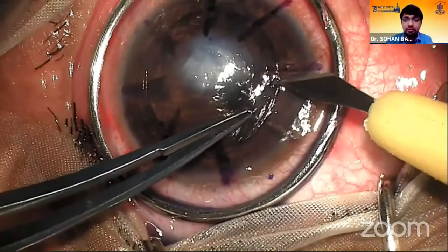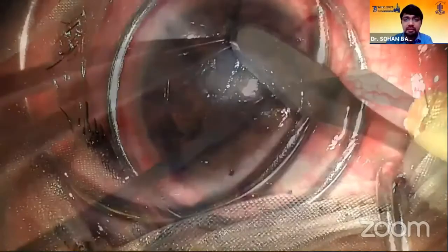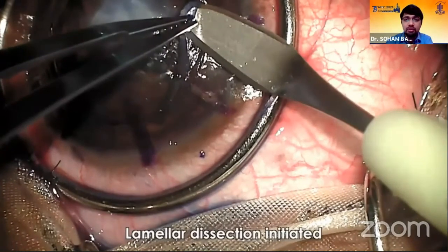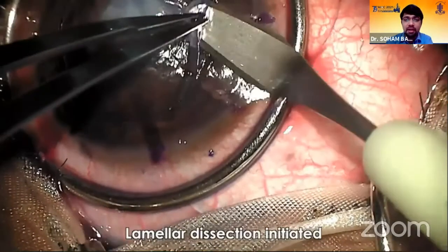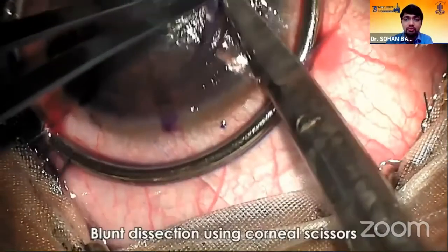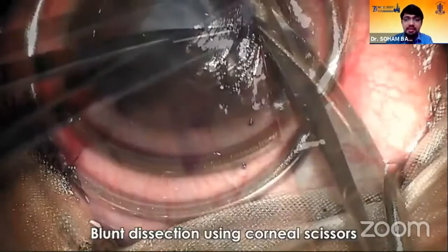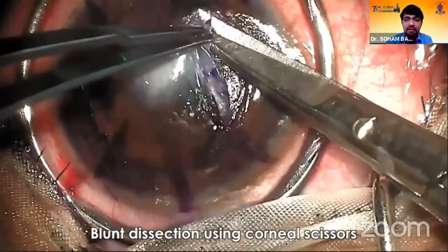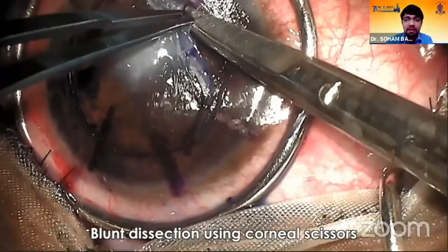And then the groove is deepened with a crescent blade. And I'm using a groove and dissect technique, where I do not touch the central cornea. So I make a groove using blunt scissor dissection along the trephine margin where the cornea is relatively thicker. So there is a margin of error over there.